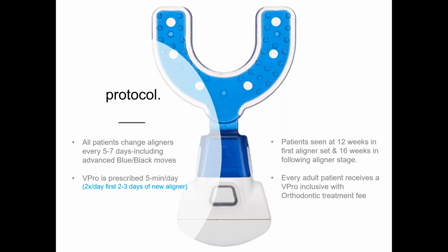Now, this is up to your own discretion, how often you want to see patients, what's involved with the case in terms of IPR and tracking the cases and your individual patients. But there are many, many doctors out there who see the patients every 12 weeks and even up to every 16 weeks, okay, after that initial aligner check. So you can spread out the amount of time that you're seeing patients, because why do you see your patients? You see your patients to perform IPR in the cases that need IPR, and you see the patients to make sure they're tracking.